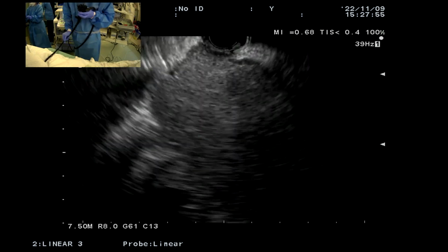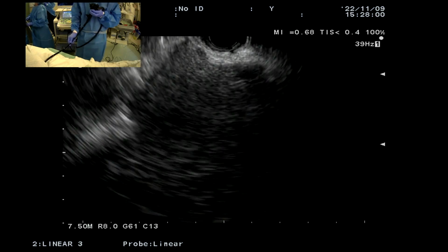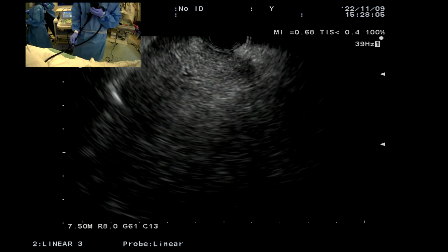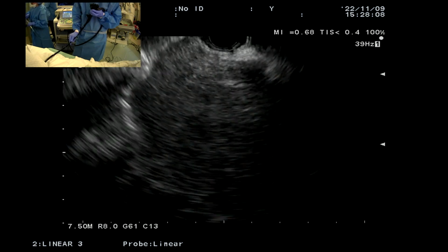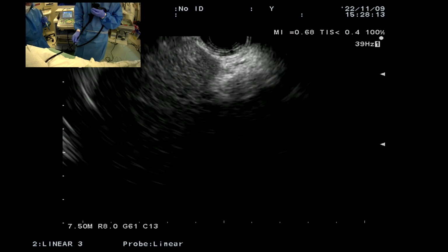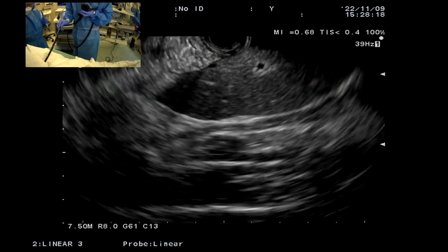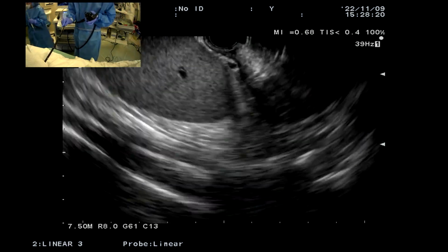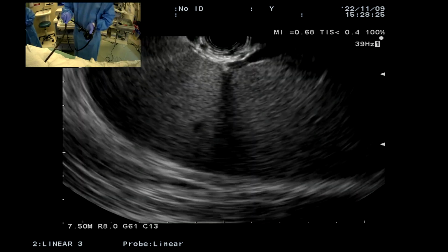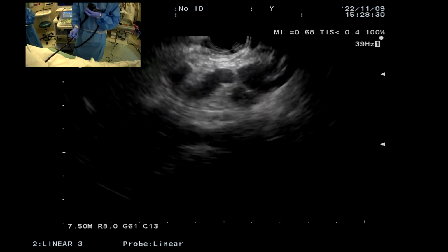And now this is the left lobe of the liver. You can see the outline. It has a sort of a granular, irregular surface, lobulated, consistent with cirrhosis. It looks like the liver is also contracted, smaller. So now we're going to just quickly look to see if there's any ascites present. I don't really see any. This is the spleen, which looks a bit enlarged, but no ascites that I can see.